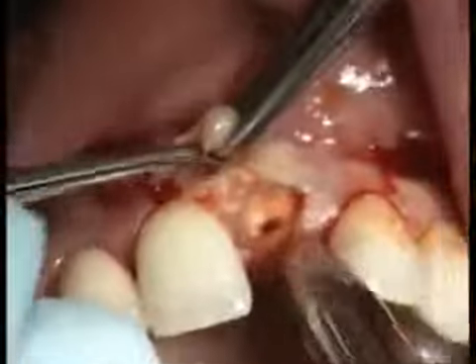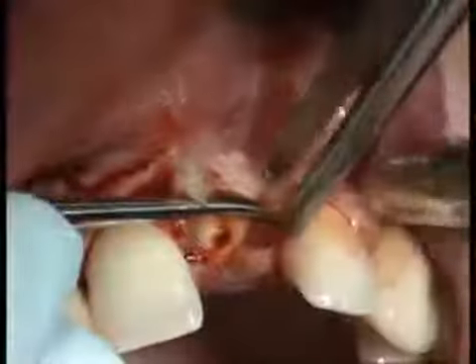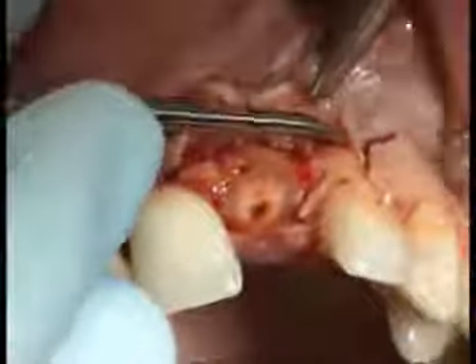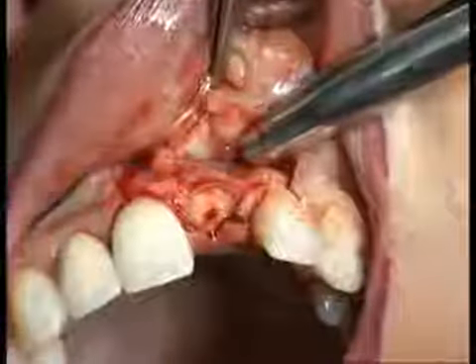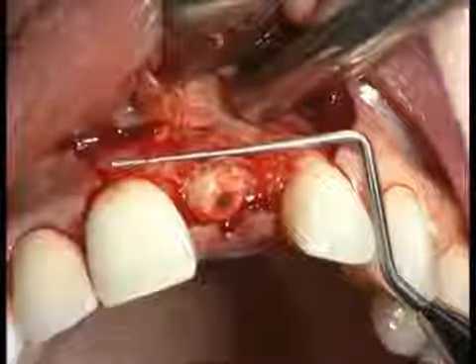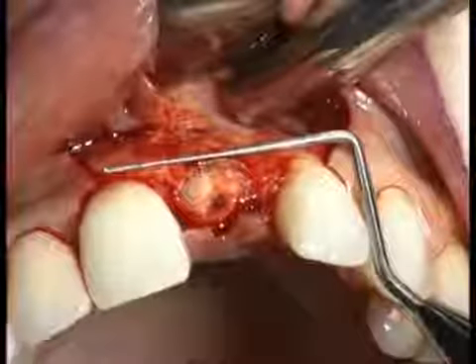The mucoperiosteal flap is elevated with a delicate surgical instrument. The periodontal probe indicates the cemento-enamel junction of the adjacent teeth and the height of the alveolar bone. Only a small defect is visible in the apical area.